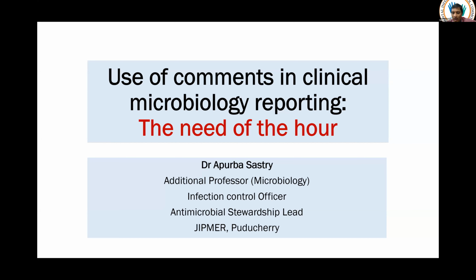Clinical microbiology reporting. This particular session I usually take for my first year residents, because when they come, they should not keep in their mind that the microbiology culture report, the culture AST report, for most of the residents or most of the microbiologists, is nothing but an ID plus the AST report. You report E. coli, like how Ketan has shown in some of the earlier reports. E. coli sensitive to ABCD, resistant to GFEH.